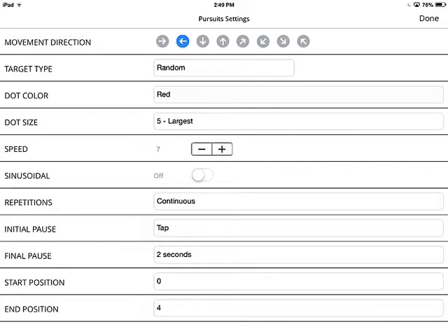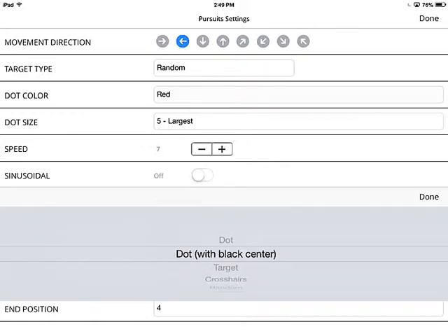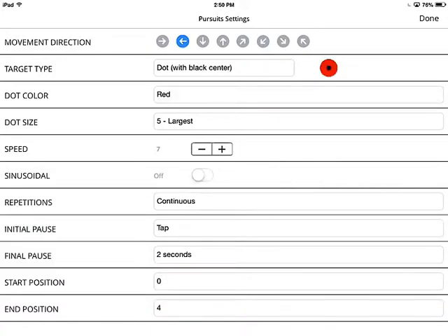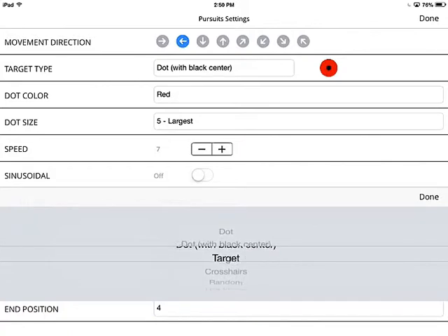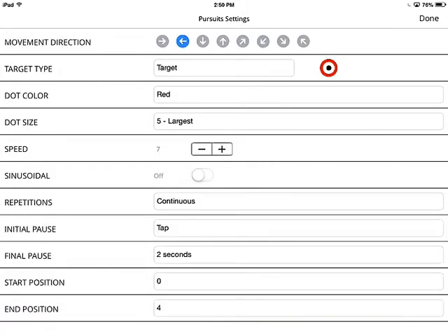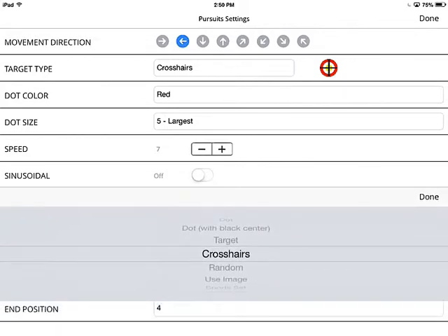The target type is another improvement we've added. You have the choice to select a simple dot, which is what the previous Focus Builder app had, or a dot with a center black dot within it, or a target, or a target with crosshairs — which is really our favorite. It's much easier to maintain focus on with the crosshairs within the dot.